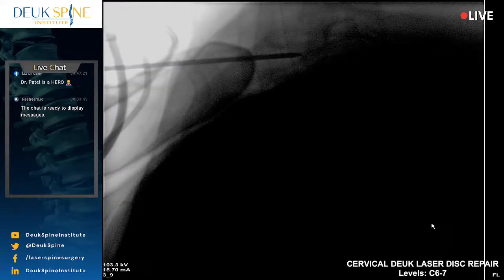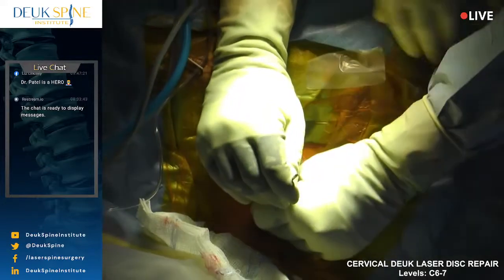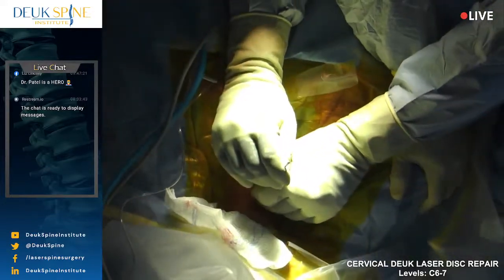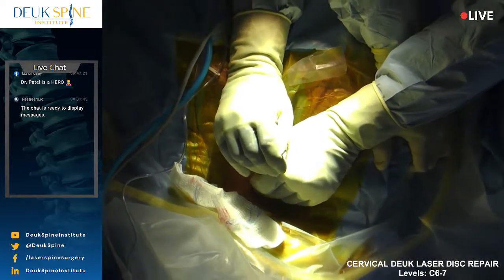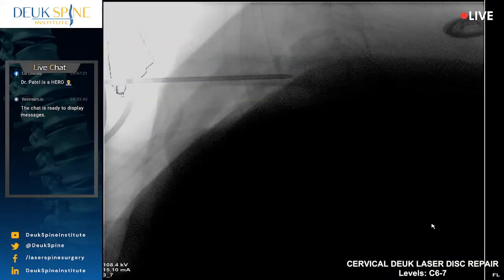That looks pretty good. If you can improve that a little bit, just a little bit. Yeah, you can see we're literally sitting on a bone spur that's right over the disc. So I'm going to take my guide wire out and I'm going to move. And I need your help, Luis. I need to move this south. So you're going to have to give me your best shoulder pull, head pull. There you go. Nice. There we go. Shot. There it is. That's it. We're there. All right, everybody relax, relax. Now I need an AP to make sure we're still in the middle.